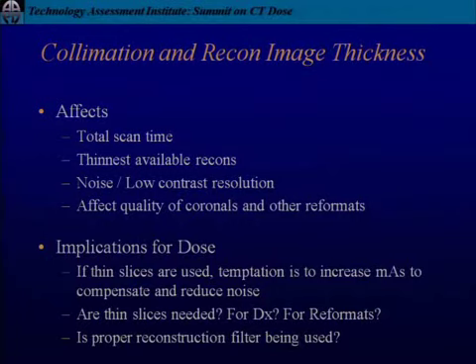Tom Payne. Your talks were very, very good. One comment, though: as we start to go from narrow beams to wider beams, in the narrow beams in the middle, the rays coming to those channels are parallel. As we go further and further out, the rays are oblique.